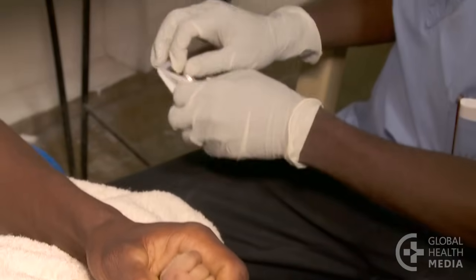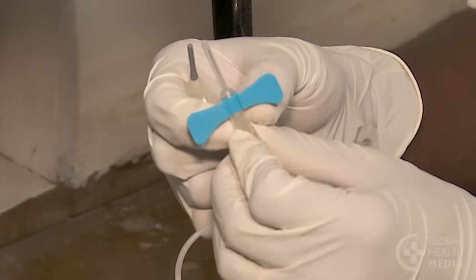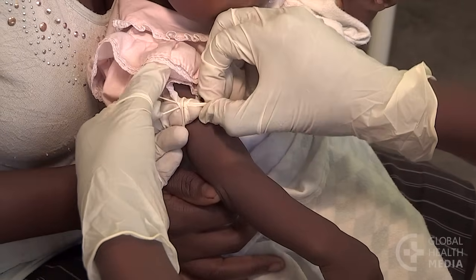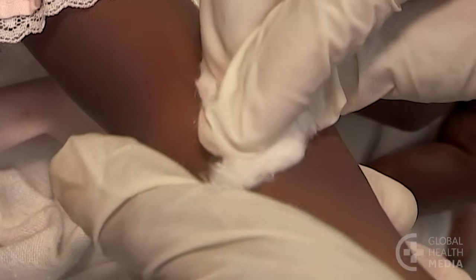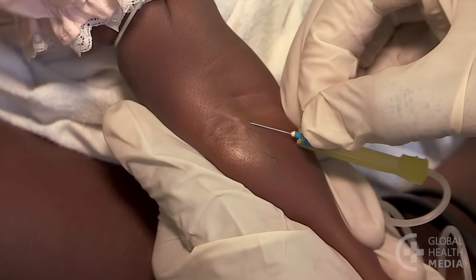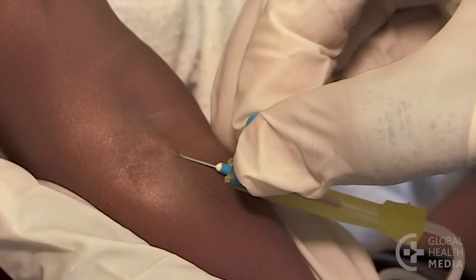The third way uses a sterile butterfly device. This is more costly but, like the needle, can be easy to maneuver. Find a good vein, then tie the tourniquet so you can easily release it. Carefully clean the skin and let it dry. Hold the skin firmly and insert the needle. Move the needle slightly until you see a flash of blood in the tube to show that you're in the vein.